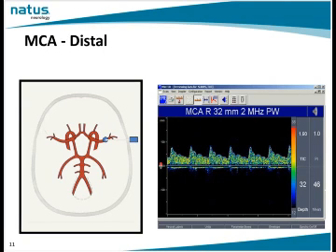You could say, well, why do I have to trace this distally? Two things. We're looking for pathology, and if we don't look at each depth, we usually go down by 2 millimeters from 50 to 48, 48 to 46, et cetera. This is how we're going to find our pathology.